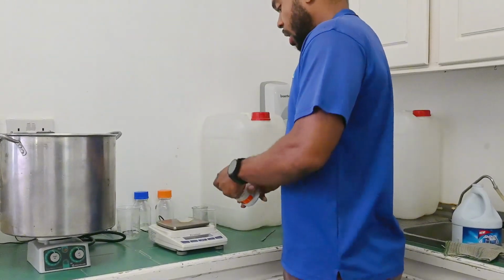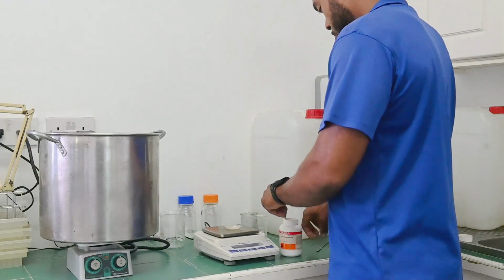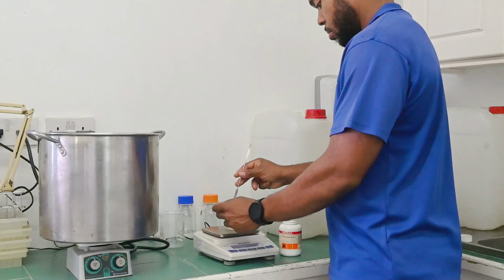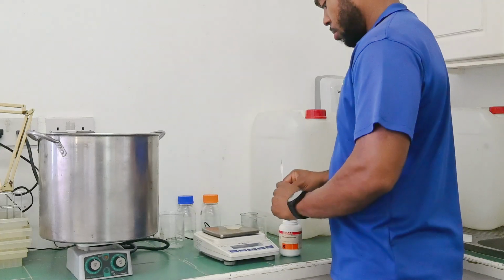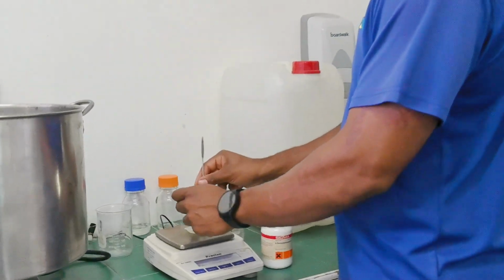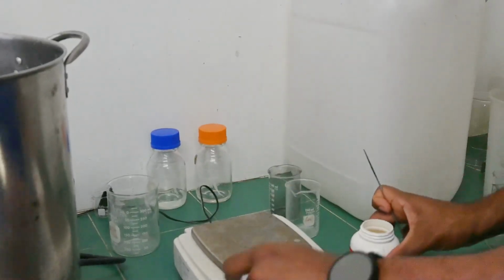Then we're going to weigh the desired amount, 0.10 grams. We have 0.10 grams.